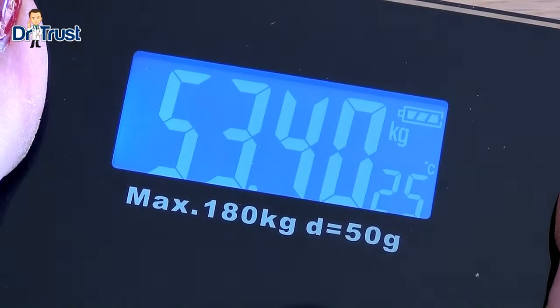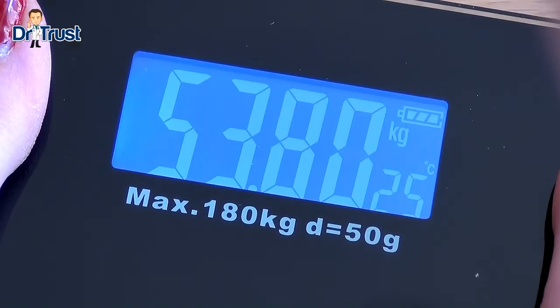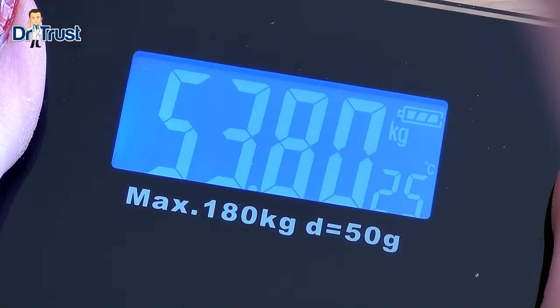The bright backlit display is clear and easy to read, allowing you to weigh any time of day or night, and even features the current room temperature in Celsius.